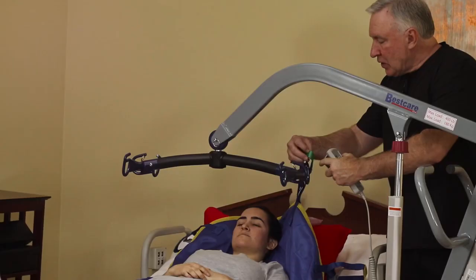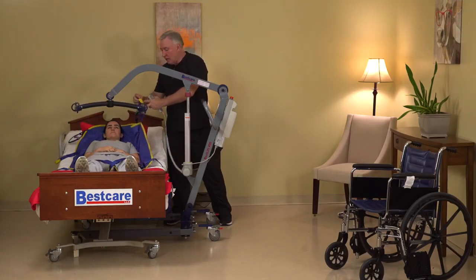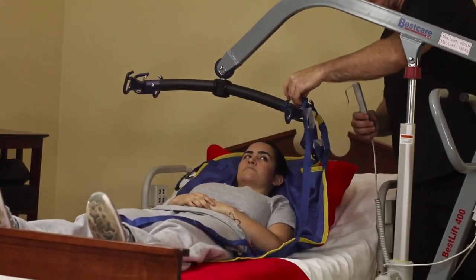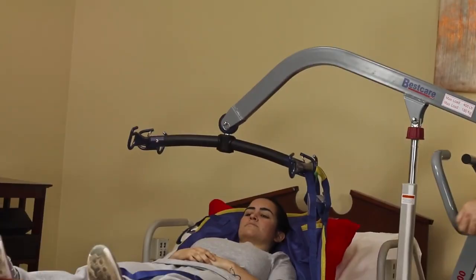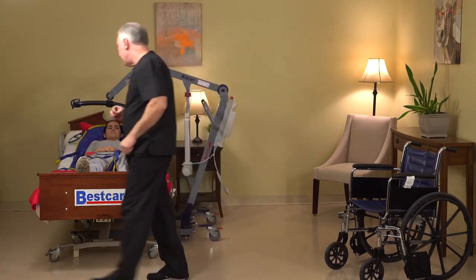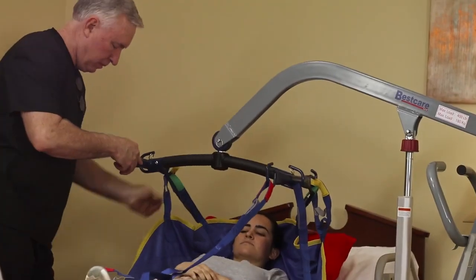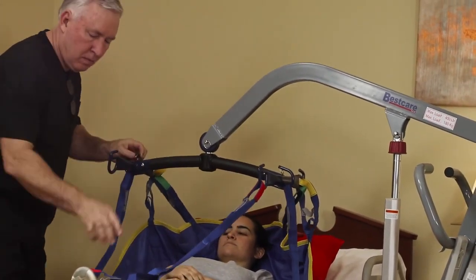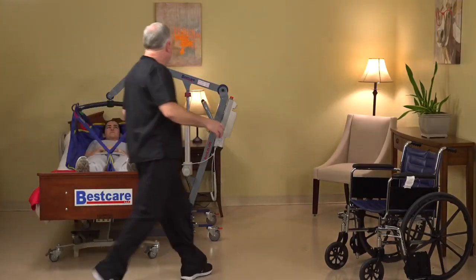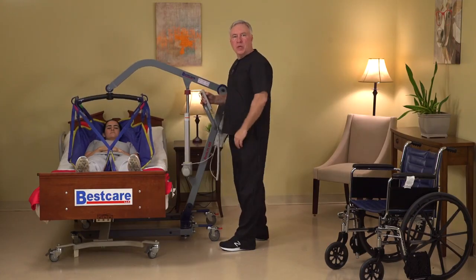So we're going to connect our first set of loops near the head to the first hook, the second set of loops near the head to the first hook as well, the middle set of loops to the middle hook, and then the leg loops to the first hook. Now we're going to do the same on the other side. And now we can raise our patient out of the bed and transfer the patient to the wheelchair.